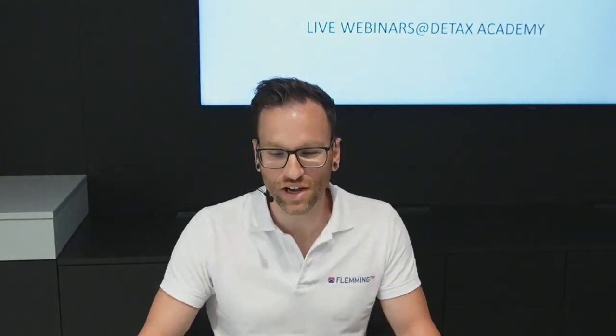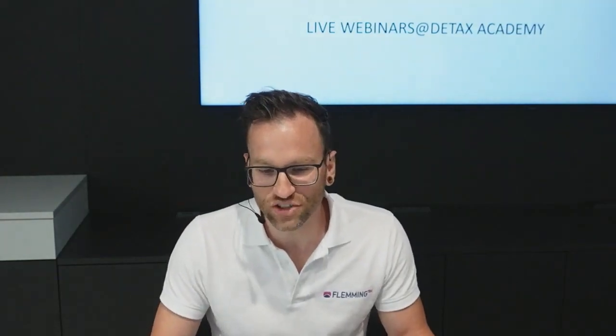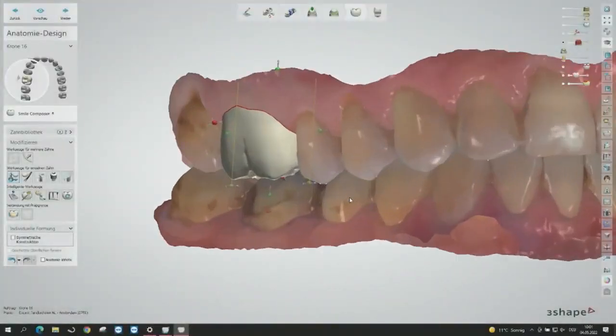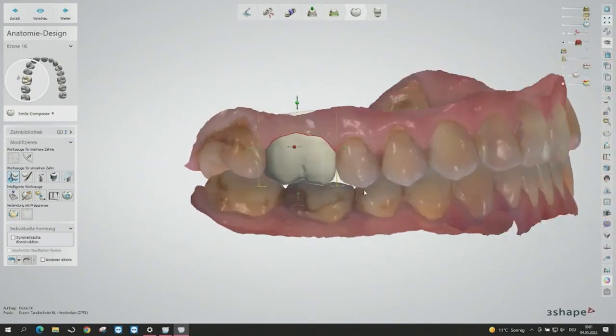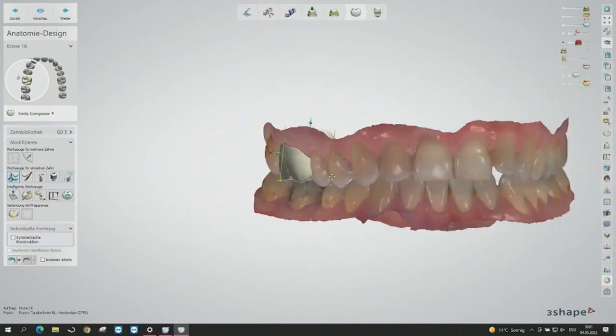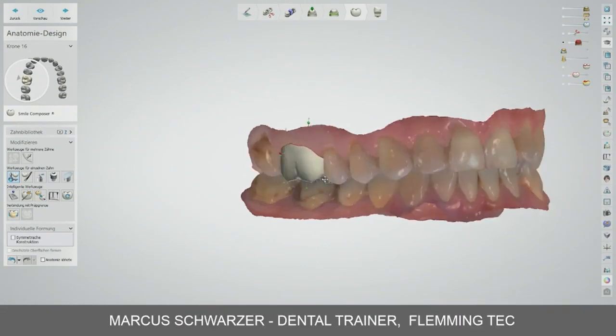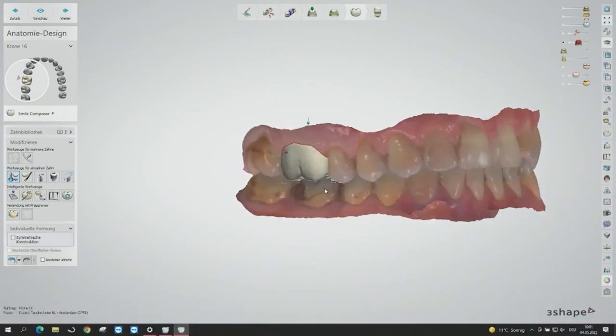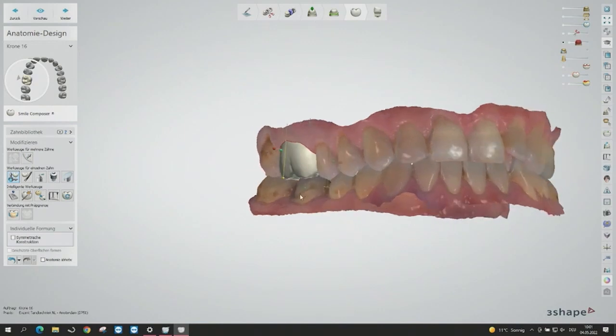Okay, Marcus, thank you. I will start directly with an original patient case like you see here in this movie. Today we want to show you the really good steps to help design a crown with good dynamic occlusion and good static occlusion.